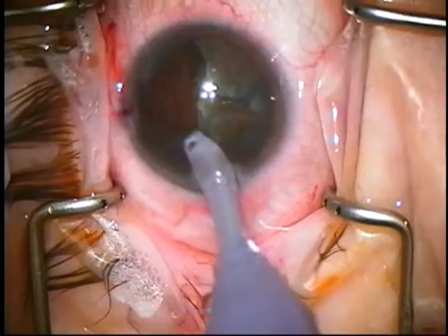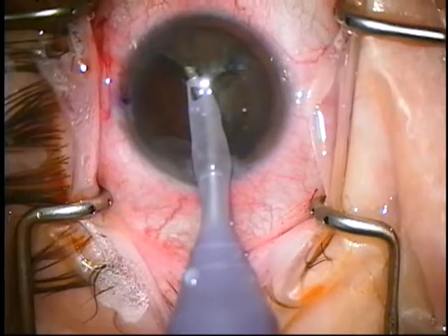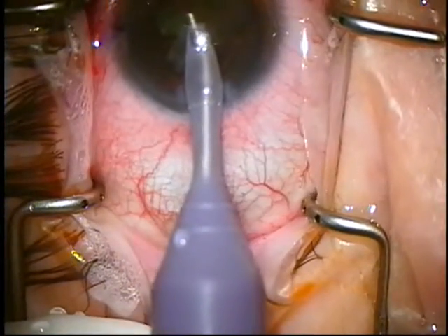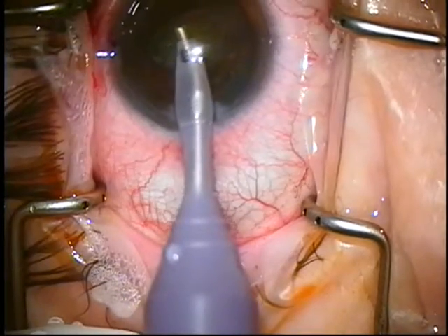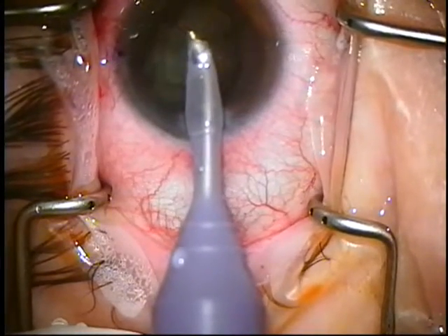You can see some cortex there, some viscoat. I'm watching to make sure I'm dead center and in the AC with my handpiece to keep it from getting posterior capsule.